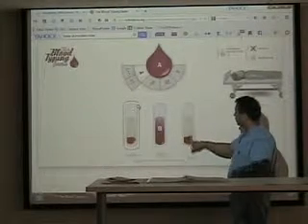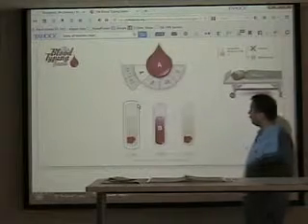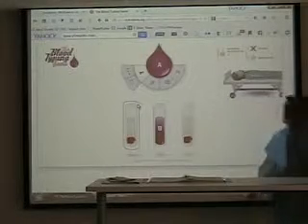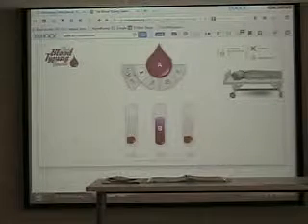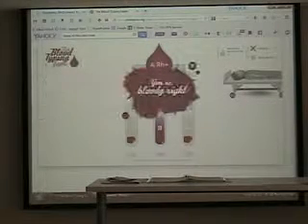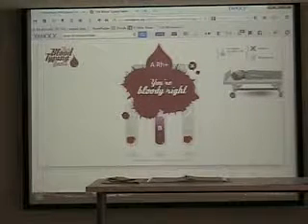Yes, I do. There's clumping, there's agglutination here. That means there is RH antigen present. If RH antigen is present, then my patient is positive for RH. So overall, my patient's blood type is A positive, and I am bloody right.